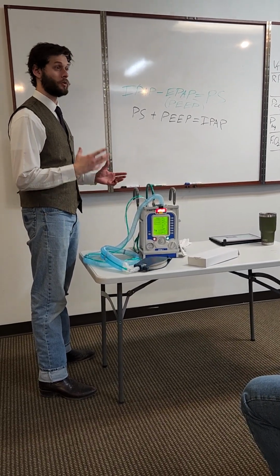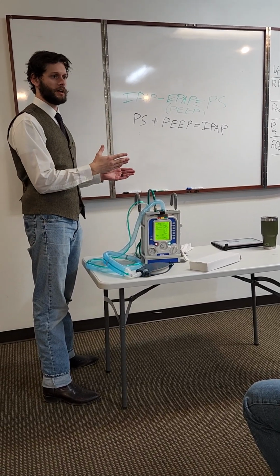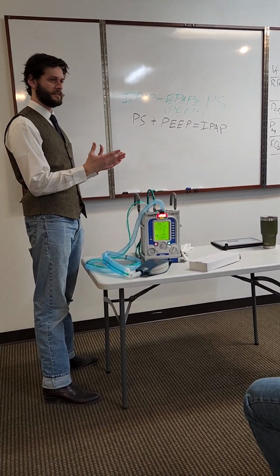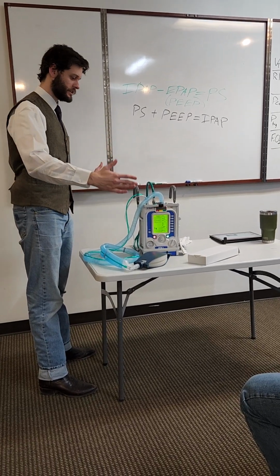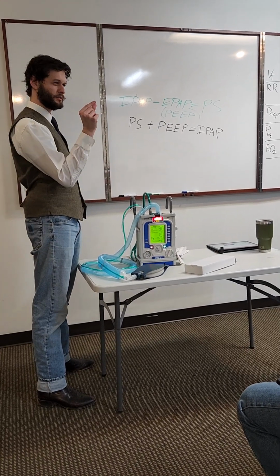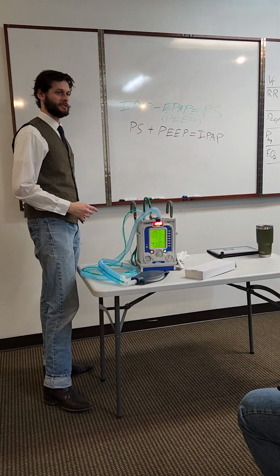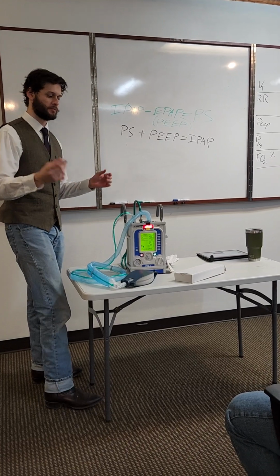We're going to be setting people up already in BiPAP, okay? If they're already in BiPAP on the super nice hospital ventilator, that I think costs about 7 times what this ventilator is, so it's obviously operating at much higher. And those things are like half the size of the table too. They're just massive machines to very minutely calculate every little thing perfect. Keeping them in that bi-level so they have their IPAP and EPAP delivery system is going to be a smoother transition and might make that 20 minutes from Midlands to Bergen a little more pleasant.